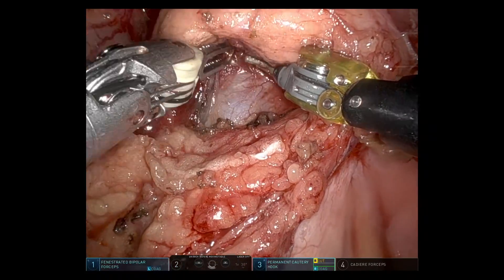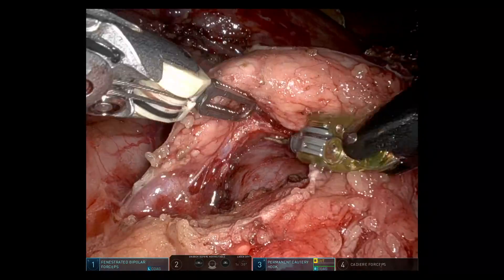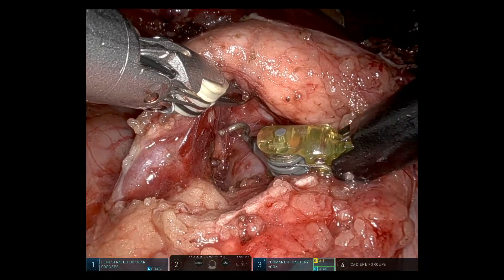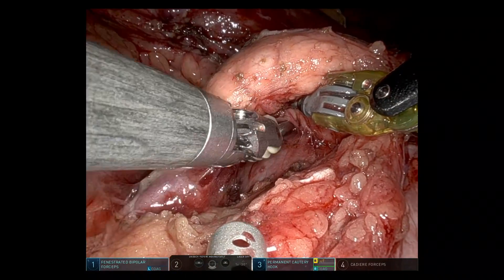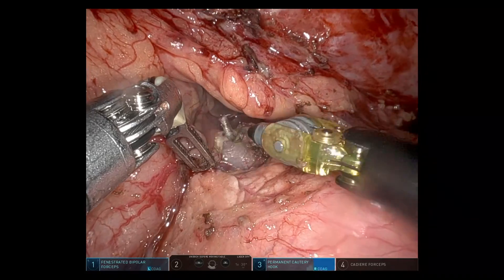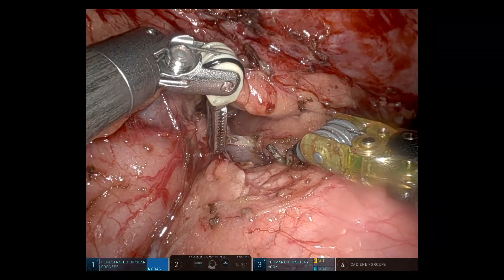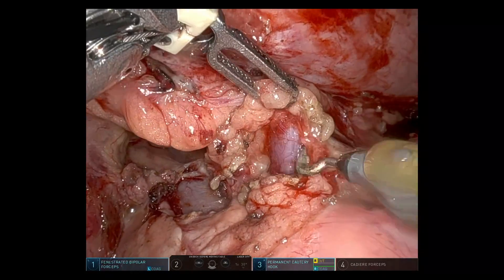I changed my view to 30 degrees up so I could get a better view underneath the pancreatic neck, just to develop that tunnel further. Then opening up the upper border overlying the portal vein to open up that top part of the tunnel.